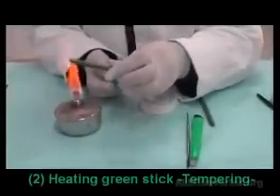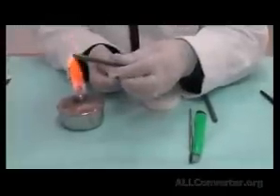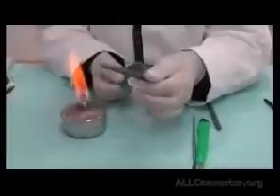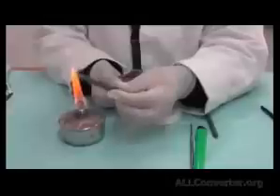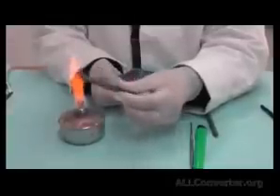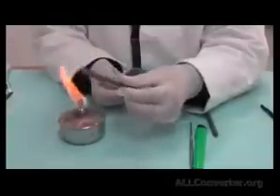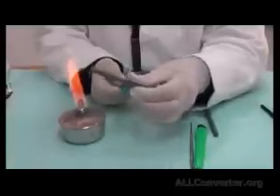The way we heat our green stick is using a flame, and this is the dry flame. We heat the material and we go back and forth. This is what we call tempering. So we're heating slowly. If it drips on the surface, I'm going to stop to make sure that part of it is flowing. Now it's in a flowable status.